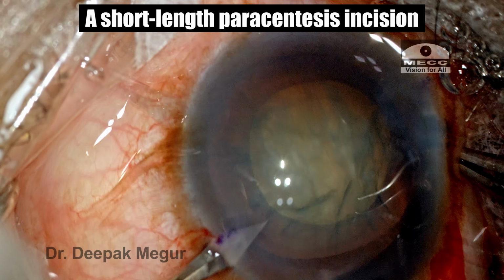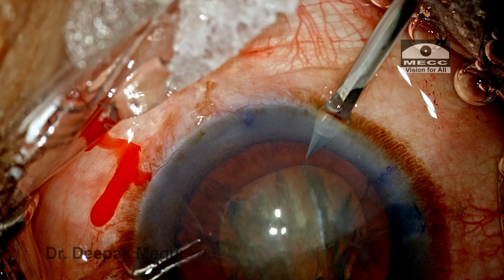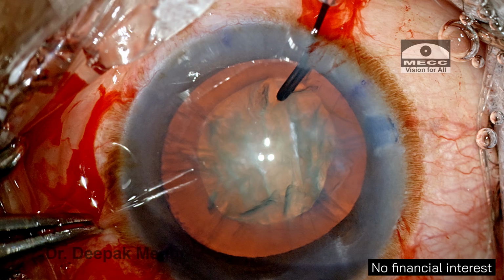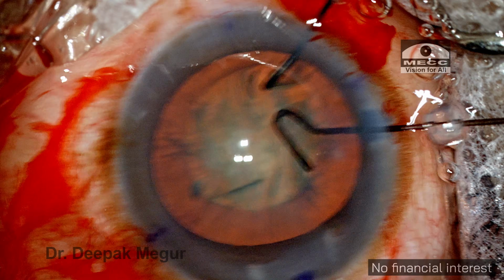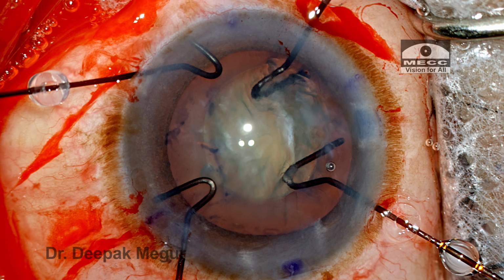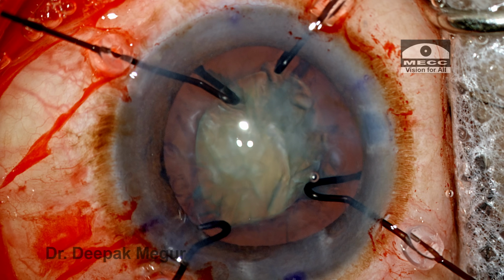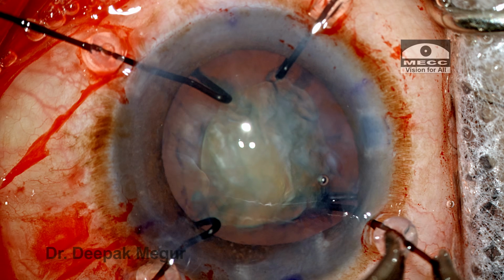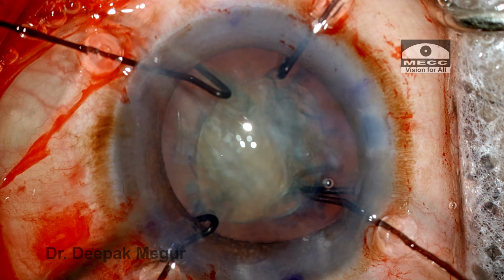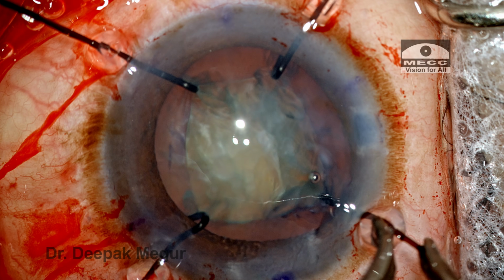I make 4 small paracentesis incisions which are posterior limbal based, and these capsule hooks, which are made by Madhu Instruments, are inserted into the anterior chamber. I usually would like to place all the hooks first in the anterior chamber, and when all the 4 hooks are there, then I would like to engage the capsular bag one by one. Care is to be taken not to overstretch the capsule, and I'm mindful of that.